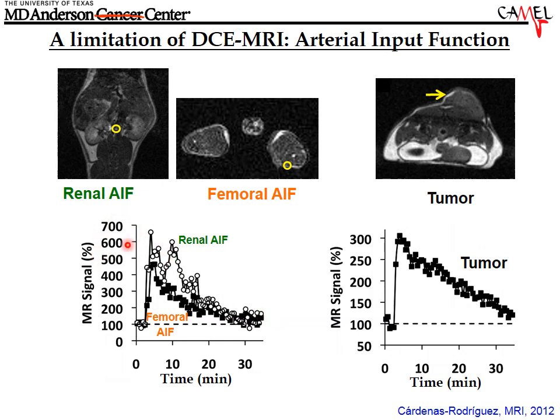You can see the scale is much larger than the scale for my data for the tumor, and the data for the tumor is much less noisy. So the problem is not trying to get accurate and precise image contrast numbers from the dynamic run through the tumor. It's really the arterial input function that is a problem.